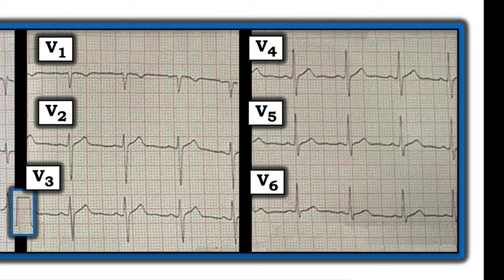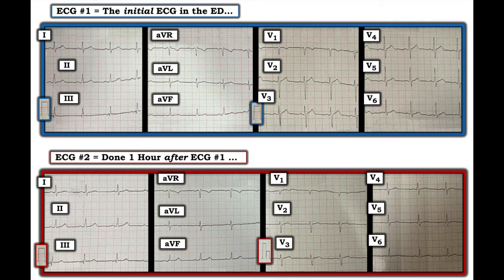This is nonspecific. This is subtle. This is non-diagnostic. In a patient with chest pain, to me, my eye says, question mark. I could not make a diagnosis from this alone, but question mark. Let's just store that for a point. And here's the second ECG done 1 hour after ECG number one. Now, remember, some point after this, this patient refused cardiac catheterization, went home, and died at home. I want you to look at the second tracing, compare it to the first tracing.